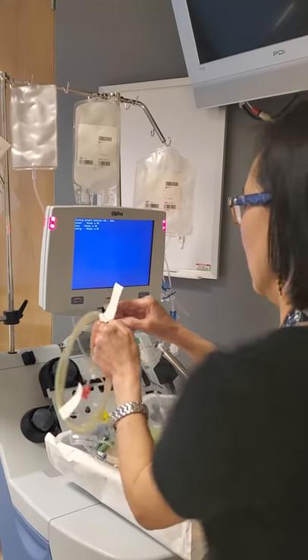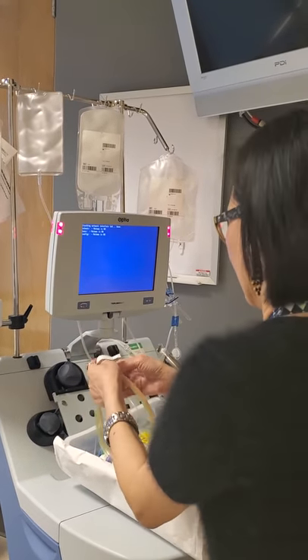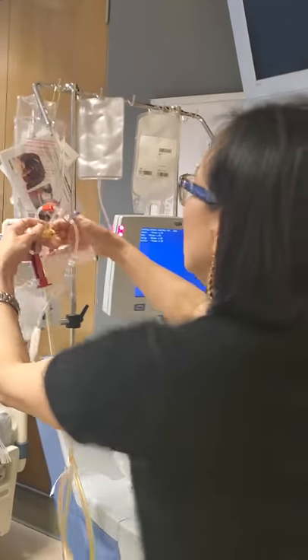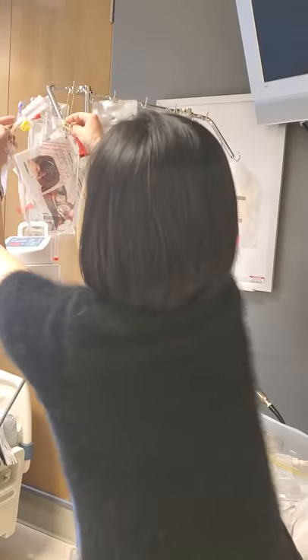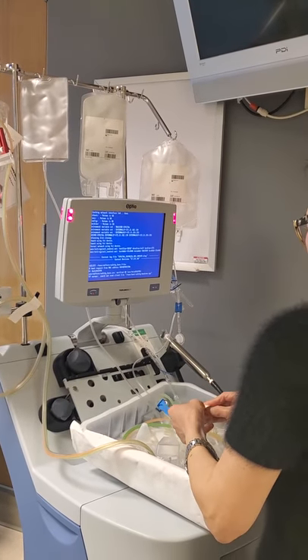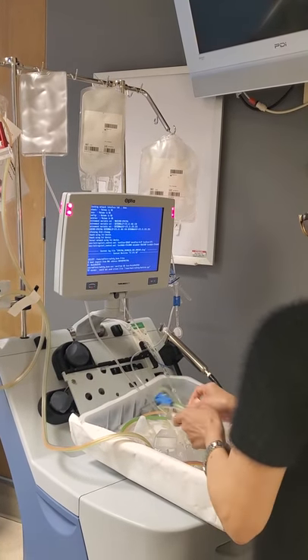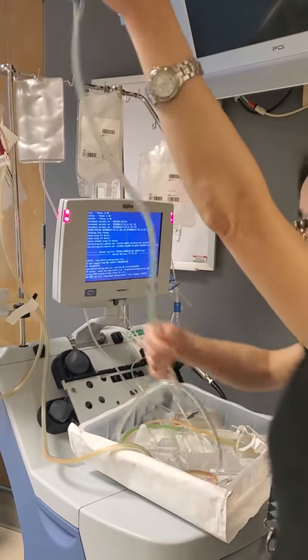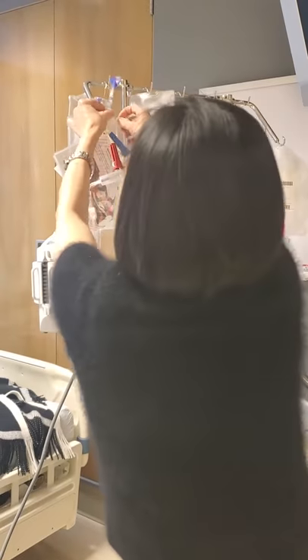Next is the coil. You've got inlet and return. Inlet has a red roller and red clamp. Return has a blue roller and blue clamp.